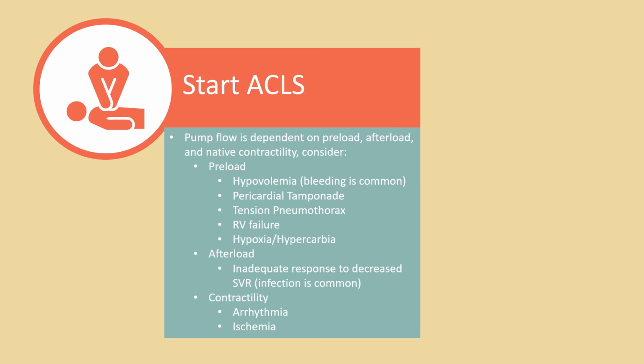And so just like in the non-working VAD algorithm, you've got your H's and T's, and we've added in V's here of VAD-specific considerations. And it's important to know that the pump flow is dependent on preload, afterload, and native contractility.